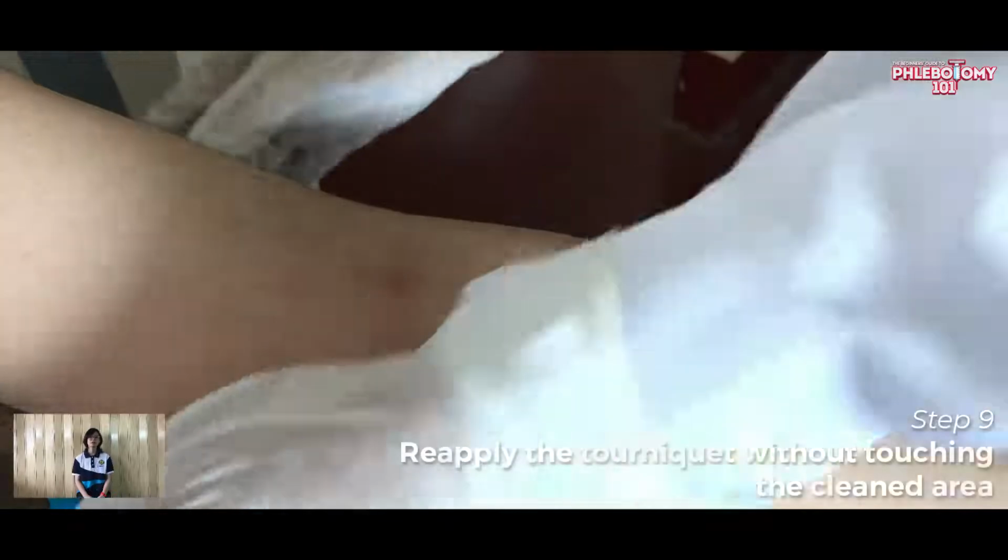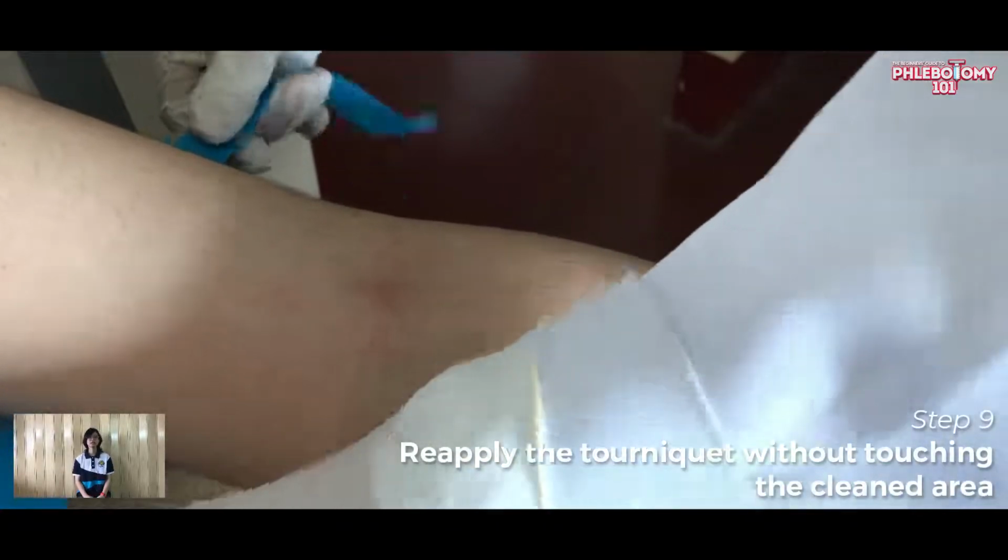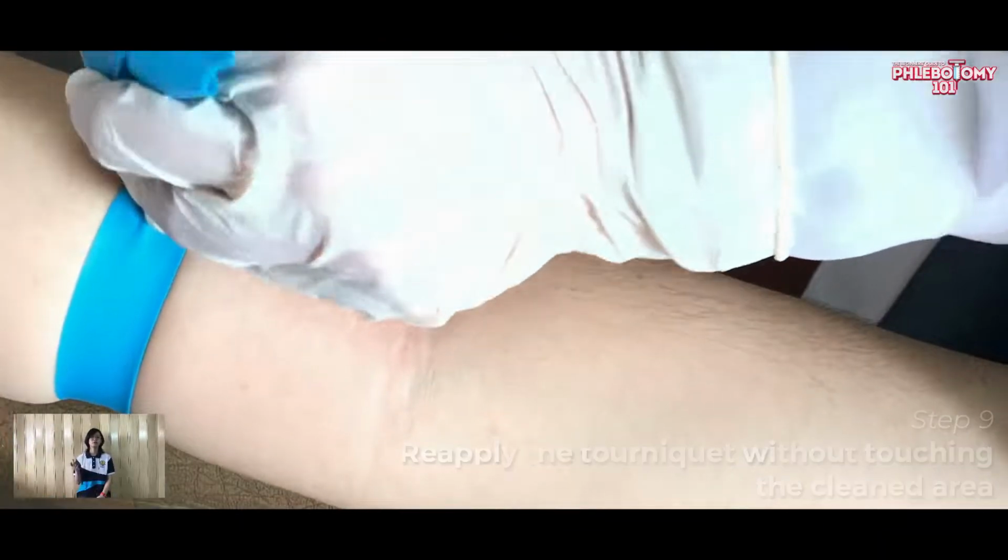Step 9. Reapply the tourniquet without touching the cleaned area. Reach for the collection equipment with your dominant hand to uncap and inspect the needle. Tandaan, kailangan sterile ang needle so it must not come into contact with anything prior to venipuncture. Replace it with a new one if it does.